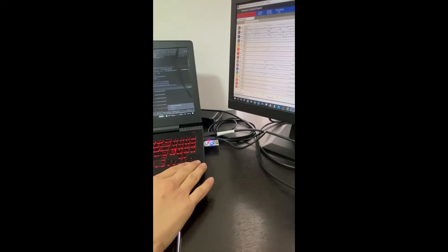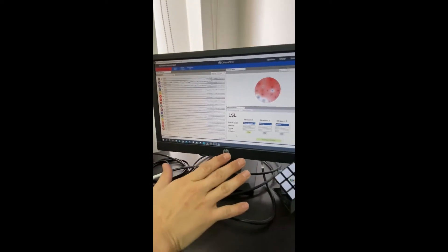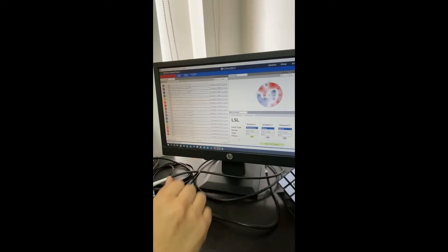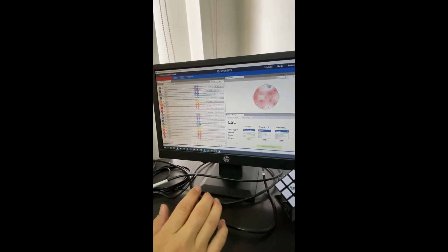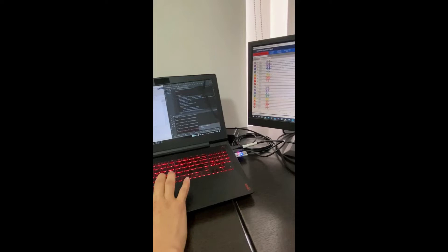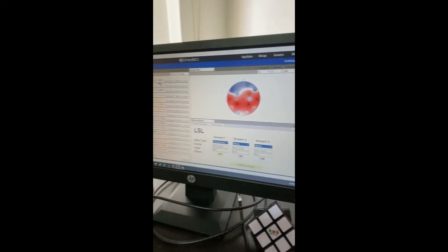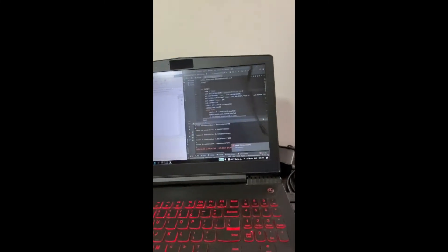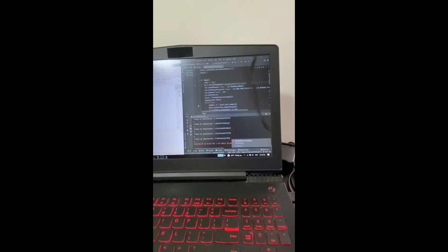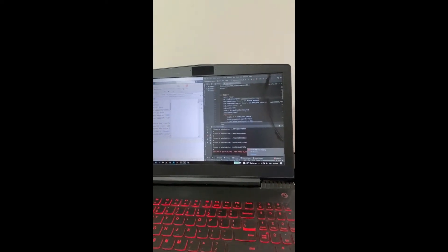The signal recording is sent to Python through the LSL protocol. Python creates a CSV file for every four seconds of recording, then notifies MATLAB through the serial port that the CSV file is ready. MATLAB then loads the CSV file for preprocessing.